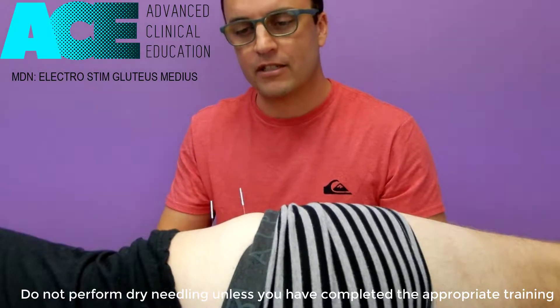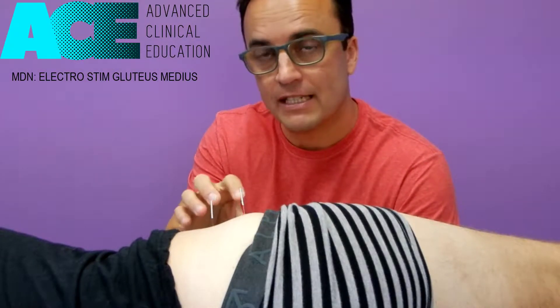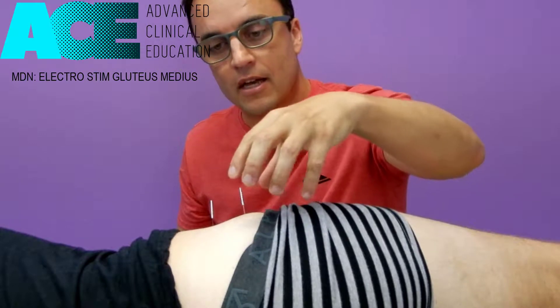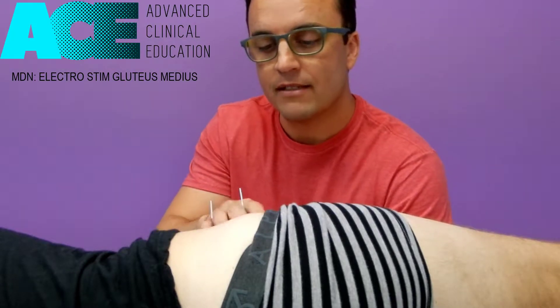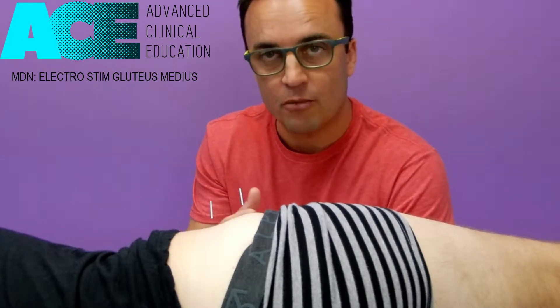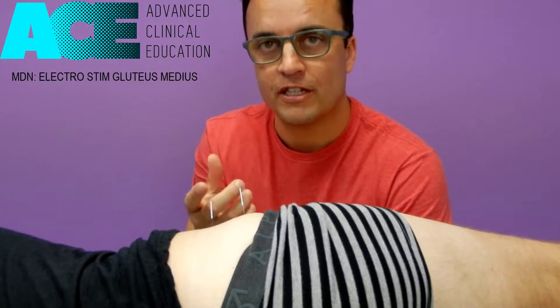For this particular presentation I'll put two needles into glute med for the situation where you might have some synergistic dominance of the TFL muscle. Many clients that we see often present with an inactive or inhibited glute med for various different reasons, and our synergist for the glute med is the TFL, so it will fire up and get very tight. We need to do manual therapy treatment, stretching, and all these other things to try to decrease tone in TFL, and then we also need to treat the glute med.